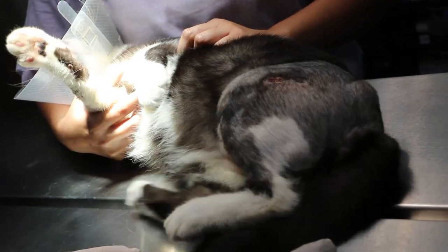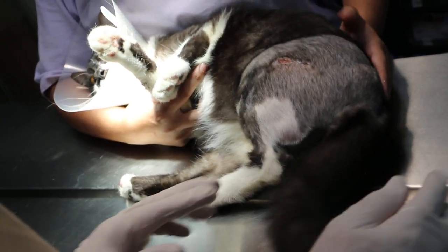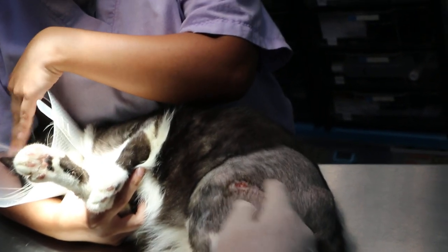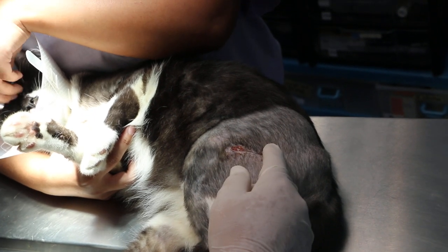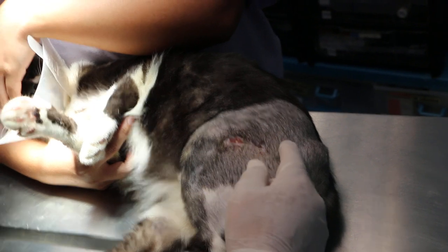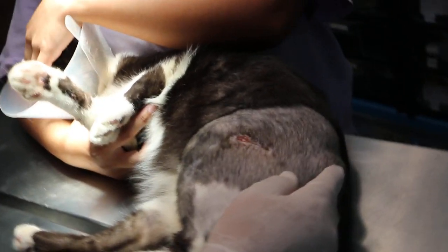19 July 2018. This cat was operated 17 days ago for a fracture of the femur. The pin connecting the fractured femoral parts — the distal and proximal segments — united the two fragments, and then the pin must come out here.